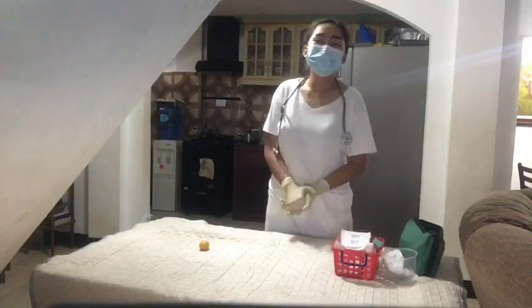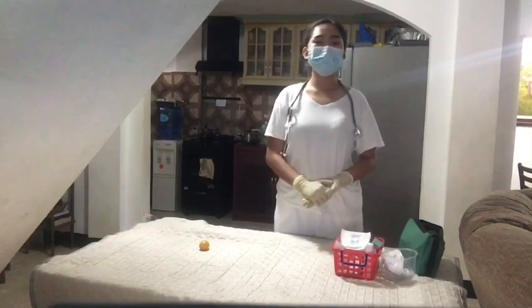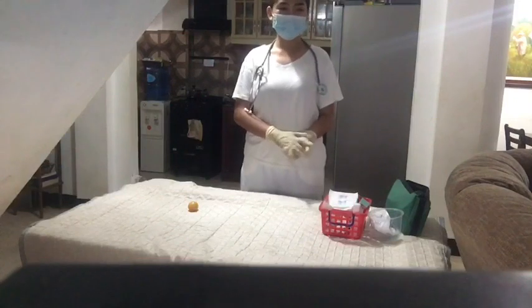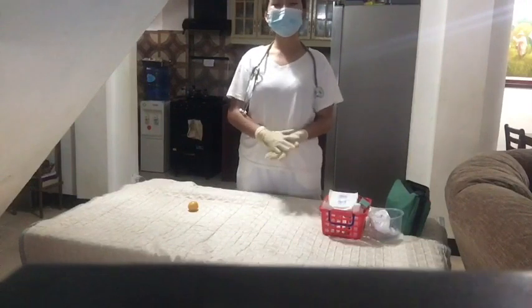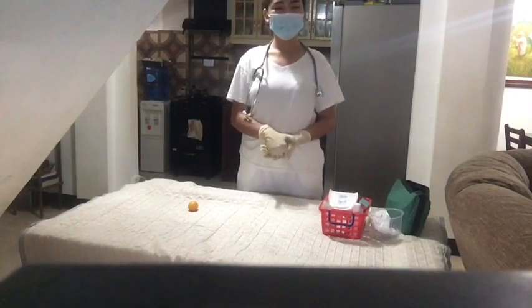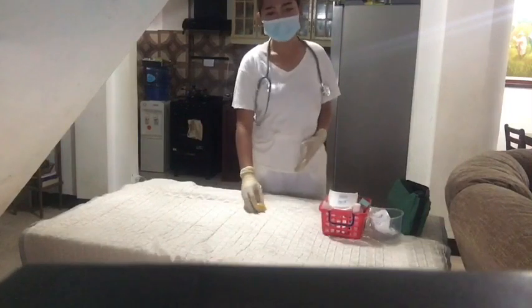After performing the hand hygiene, we will now proceed in preparing the medication from the vial or ampule for drug withdrawal. Organization of necessary procedure facilitates accurate skill performance. And after which, we'll now introduce ourselves and verify the client's identity. And also, we will provide some privacy. This is to give assurance to the client and verify the client's identity by checking the ID band or bracelet to gather information. So, assuming that the patient is this Tomato.